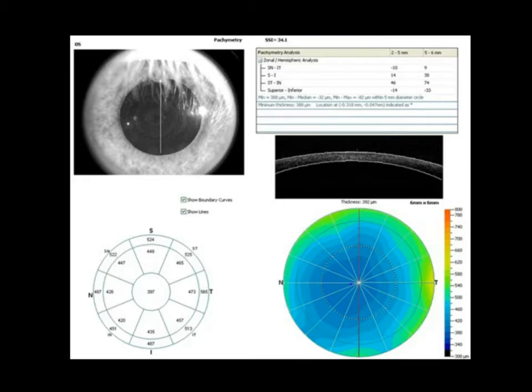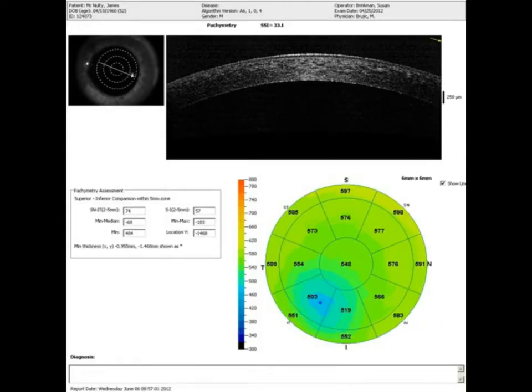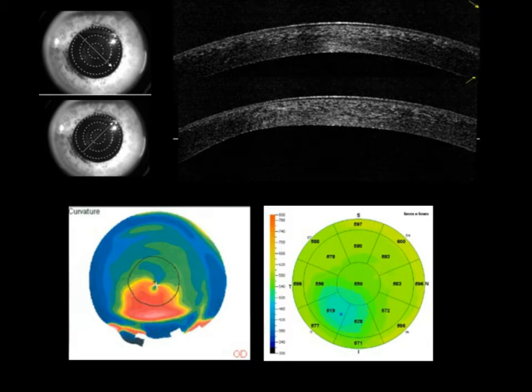What else are we looking at with anterior segment OCT? Well, certainly keratoconus, pellucid marginal degeneration, or any of the corneal ectasias. We're actually not only at this point monitoring with corneal topography, but we're also measuring corneal thicknesses. Why? Because we can actually see a corresponding thinning in the exact same area in these individuals where we actually see corneal steepening. What we've also been surprised at is that at times you'll see differences in corneal topographies versus OCT corneal thicknesses. Again, make sure you keep in mind that the left-hand side is literally an imported image from our topographer.